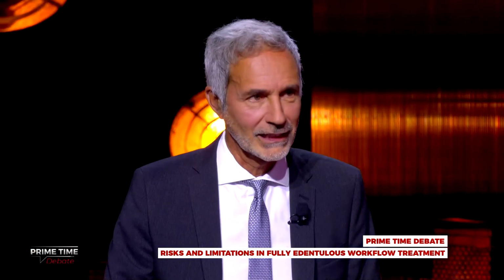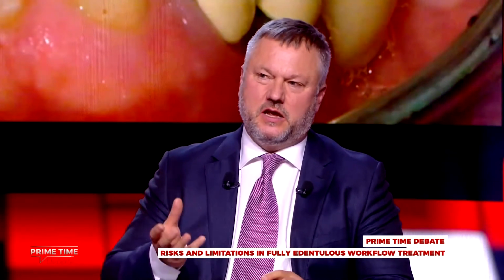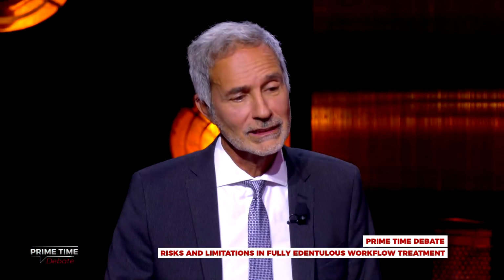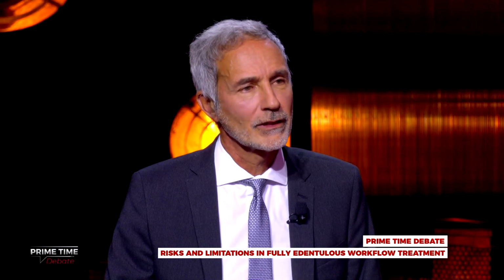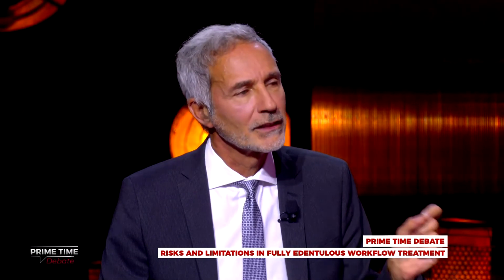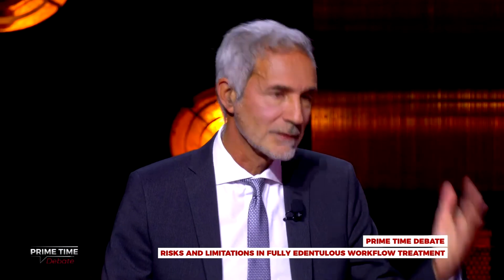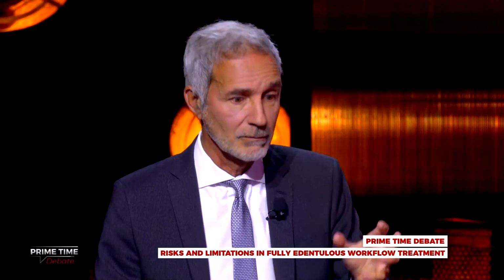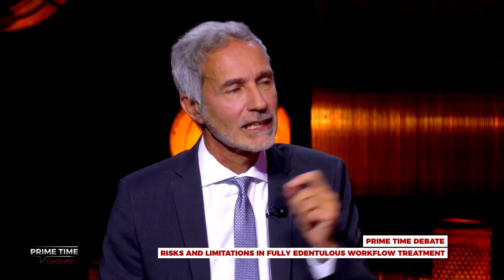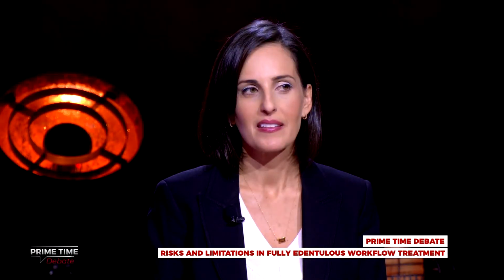But Sergio, going digital, it's a little bit old-fashioned doing this relining with acrylic in the mouth of the patient. It is important if you want to be sure that you have erased all the little mistakes in your planning. From the planning stage, from the CBCT, the making of the guide, the surgical phase, you can add some little mistakes, and a very quick relining can solve the problem.